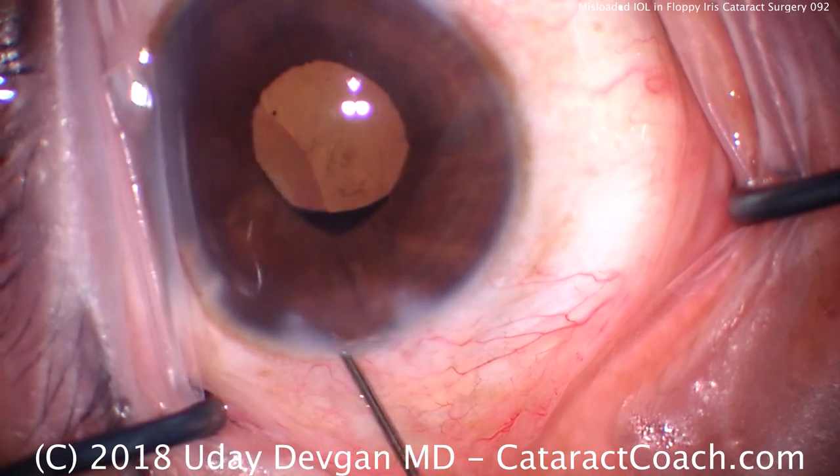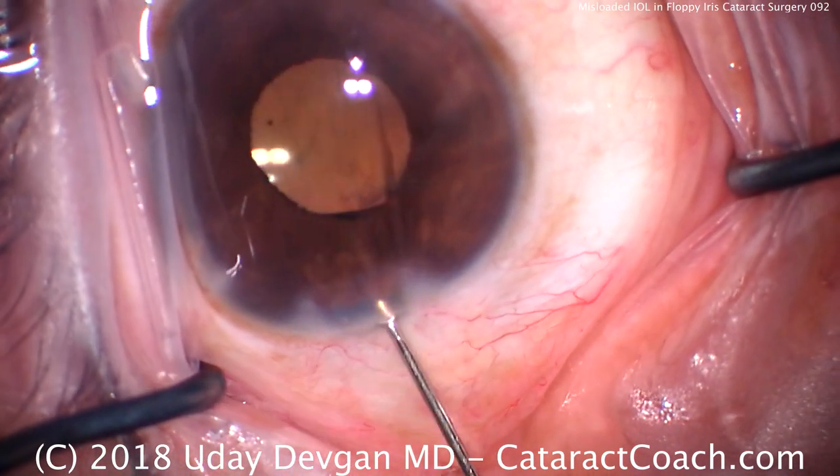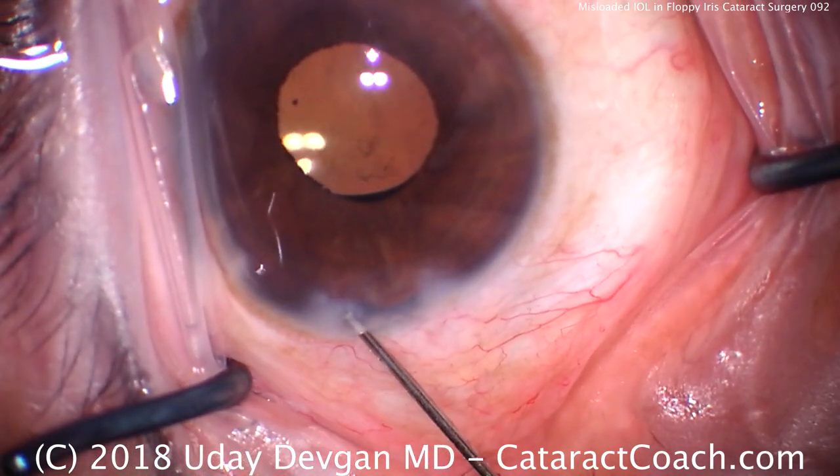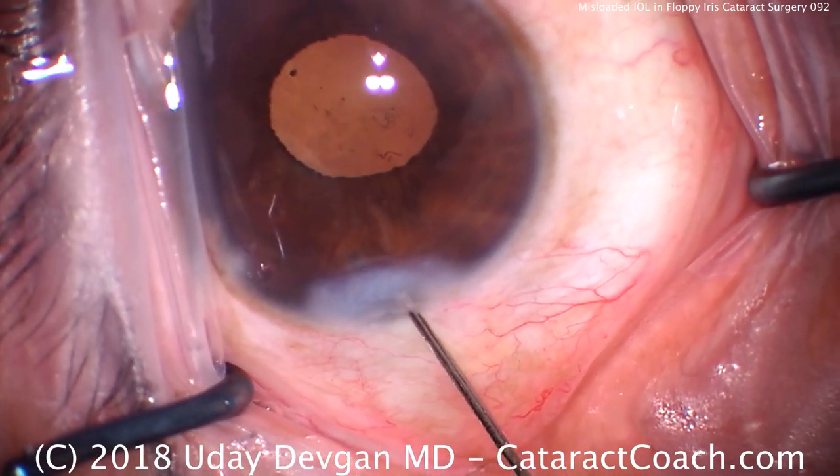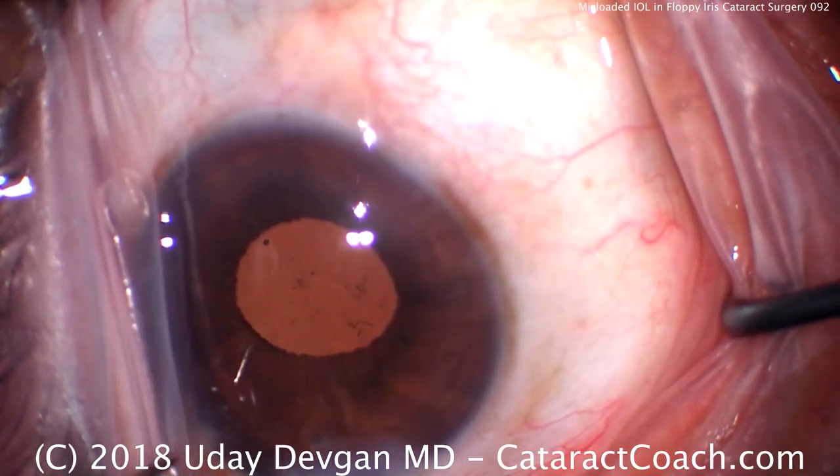First let's get the iris back in the eye — a little bit of a push of the iris there. Then hydrate the incision. I don't mind if the AC is flat now, that's okay. Now that's hydrated and sealed.